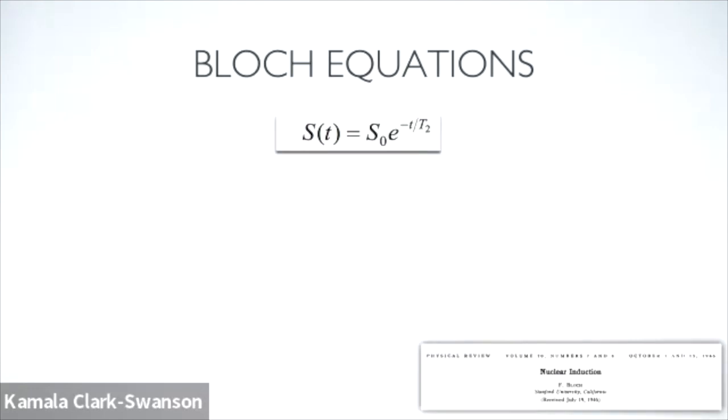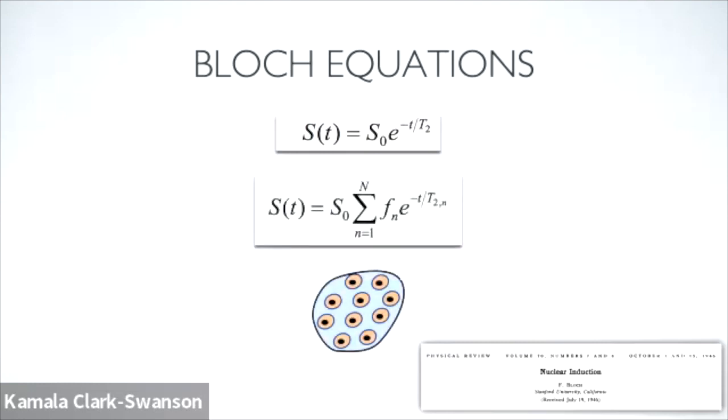And that basically is just characteristic of tissues. And so different tissues will have different T2s, and that shows up as a different brightness or darkness on the imaging based on whatever that decay rate constant is. And if you start to think about the tissue not just as a whole thing, but as different compartments within the tissue, thinking about intracellular versus extracellular compartments, then you can think about this signal as being due to this weighted sum of the signal that's coming from both the intracellular as well as the extracellular space.